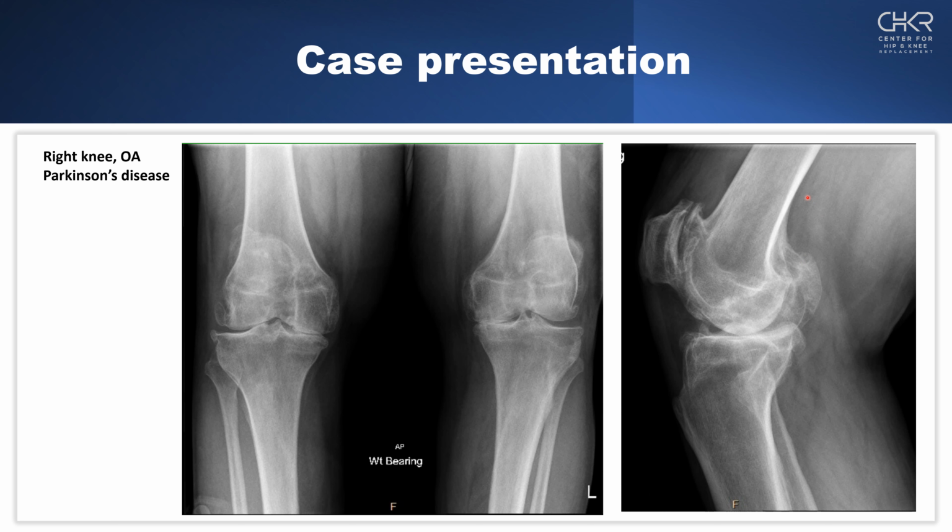We know it's stiff on clinical exam. We can see the associated osteophytes in both planes. And then on top of that, he's also stiff just because he has Parkinson's. He has an underlying rigidity, and he has something that compromises his balance. I'll show you how we deal with the mechanical rather than the neuromuscular aspects of his stiffness.